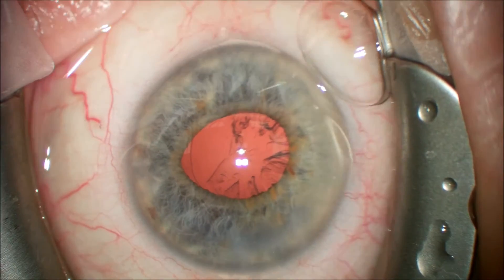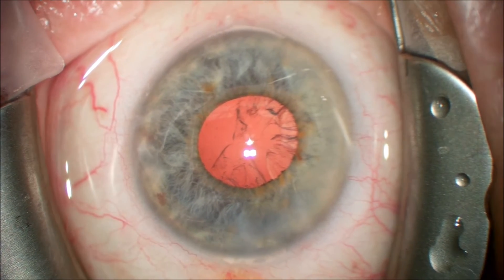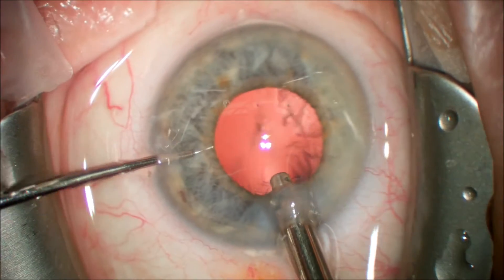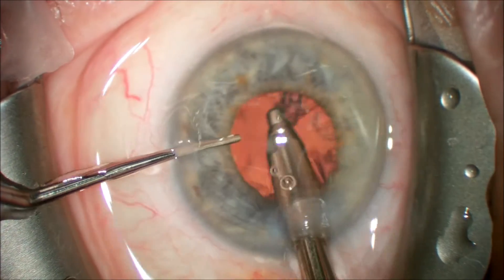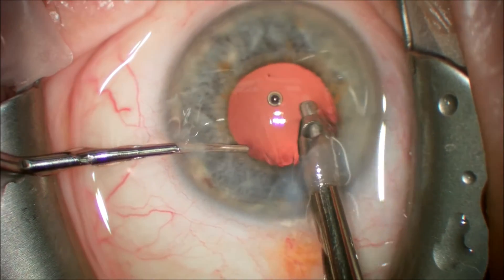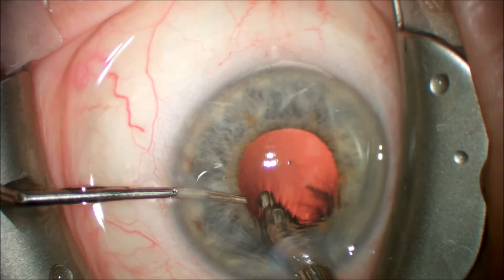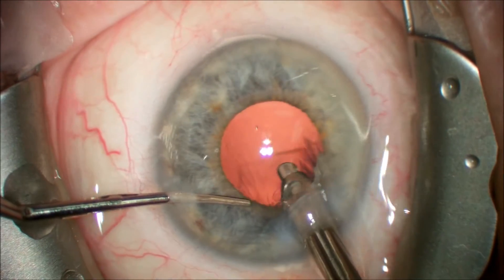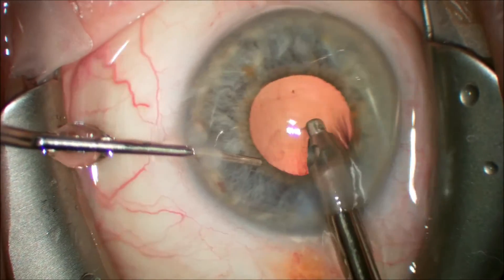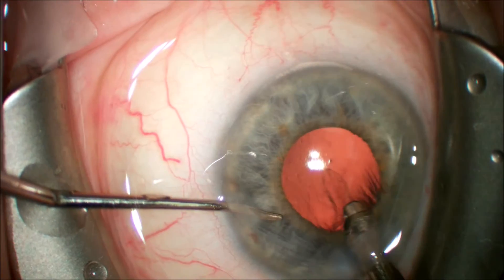With the nucleus completely disassembled, we will change to irrigation aspiration and remove the remaining cortical material. This is always more difficult in cases of small pupils as visualization is difficult of the peripheral cortex in some instances. Cortical material is removed from peripheral to centrally using an automated irrigation aspiration technique. The circumferential removal of the cortical material is done in a standard method. A nuclear chip was removed with the irrigation aspiration handpiece and now the sub-incisional cortex will be removed using this same technique.